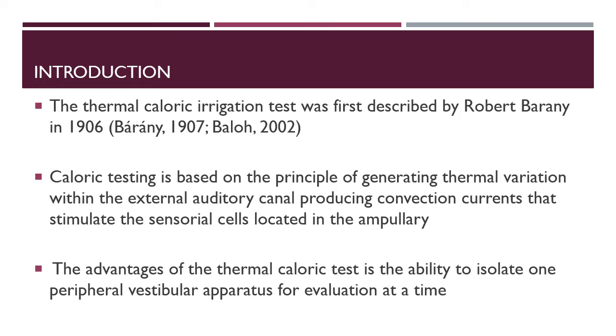So let me first give you a brief overview on the introduction of the caloric testing. This thermocaloric irrigation test was first described by Robert Barany in 1906. Barany observed that when water cooler than body temperature was infused into the ear canal of patients sitting upright, nystagmus was elicited with a fast phase directed towards the opposite ear. Alternatively, when water warmer than body temperature was infused into the ear canal, the nystagmus was elicited with a fast phase directed towards the same side.